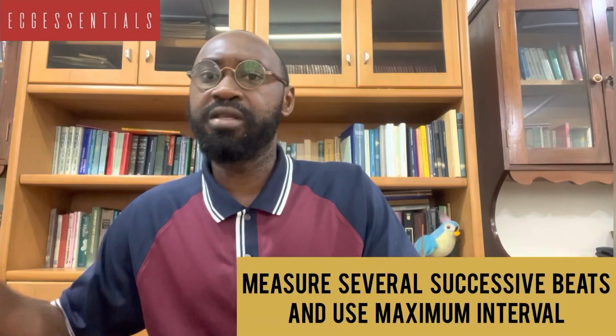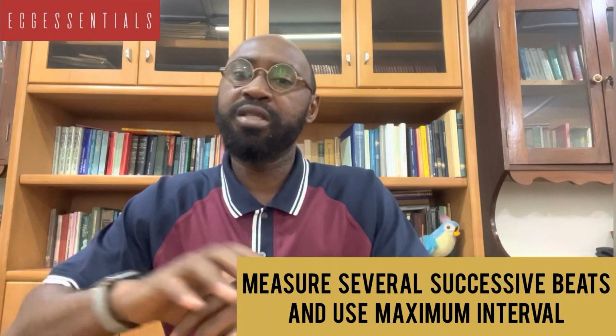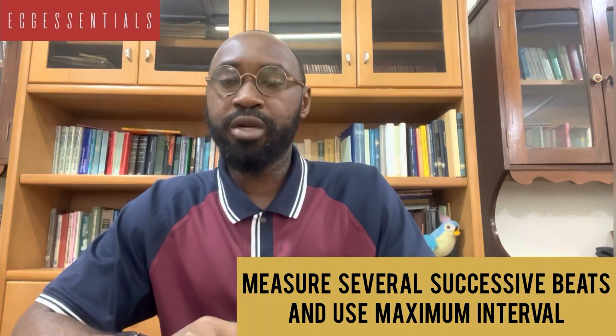So somebody may be interested in finding out how to measure. Are there any things to pay attention to when we are measuring the QTC? Remember, we have said that for the QTC, once we get the QT, there are several formulae and even online tools that we can quickly use to compute. But in reading the QT from the ECG itself, we need to make sure that we are not taking just one reading, but looking at several successive beats, so that we arrive at the maximum interval, and it's that maximum interval that we need to use.